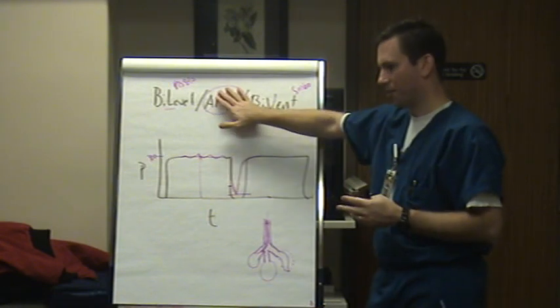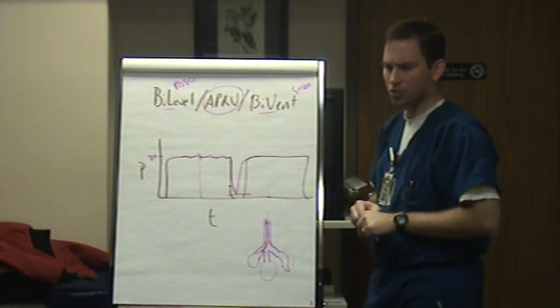So tell me the advantage of APRV. Why would you move to it? When would you suggest it?